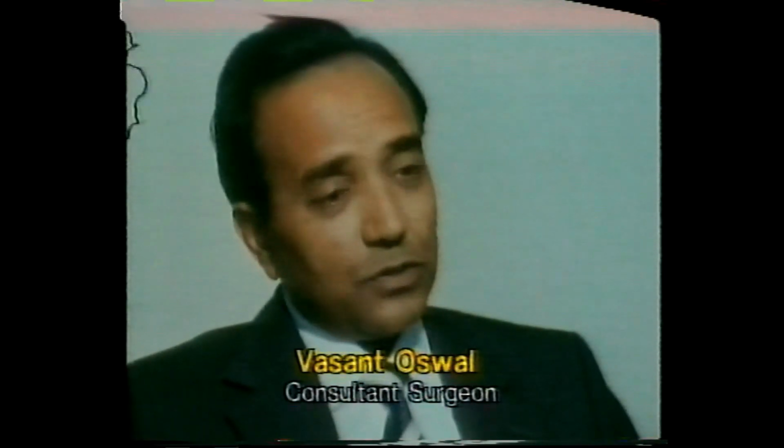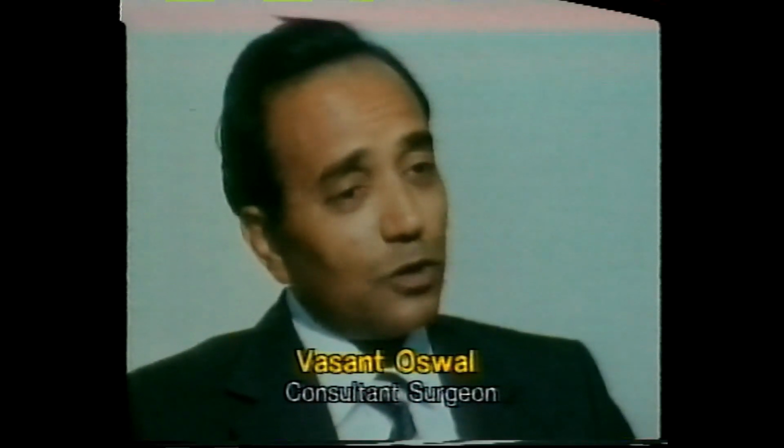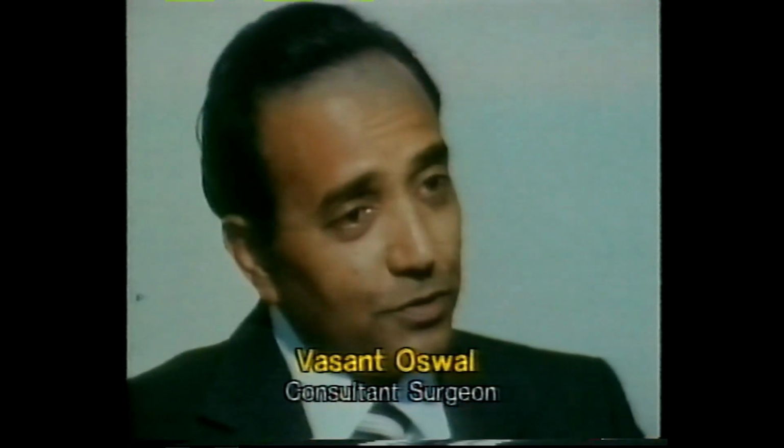The surgery is nearly bloodless, bloodless to the extent that there is not a red spot around during the surgery. The recovery from the surgery is very quick. The hospitalization is short. The patient after this kind of surgery can perhaps go home second day, third day. They have gone home second or third day. And this is following a major excision of the tissues in the larynx and on the tongue and the floor of the mouth.